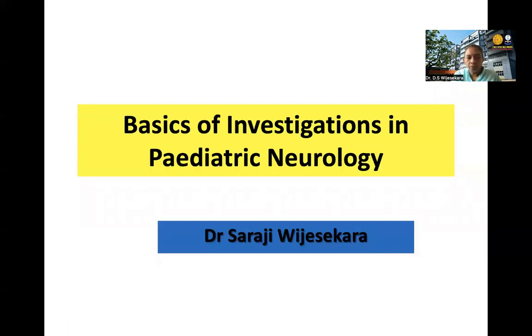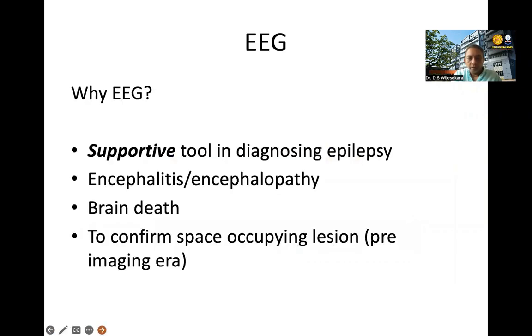Today, I'm going to talk about basics of investigations in pediatric neurology. I will start with the EEG. So why do we need an EEG or electroencephalogram? It's a supportive tool in diagnosing epilepsy. It's a supportive tool. I have highlighted that.